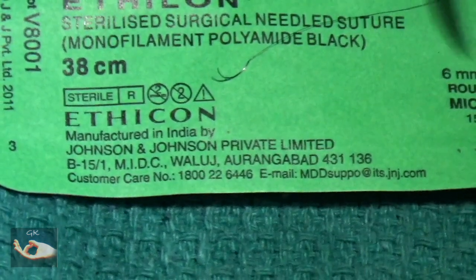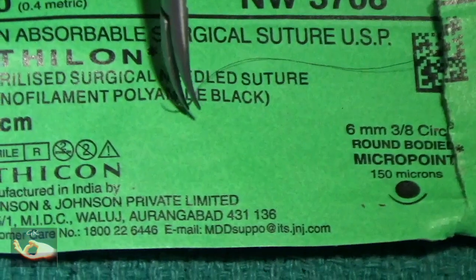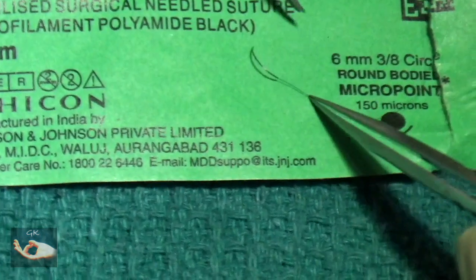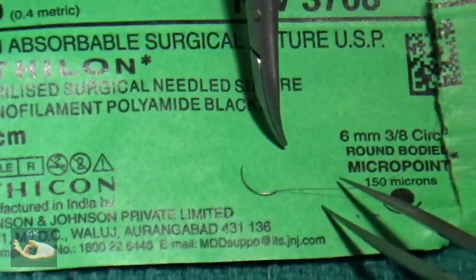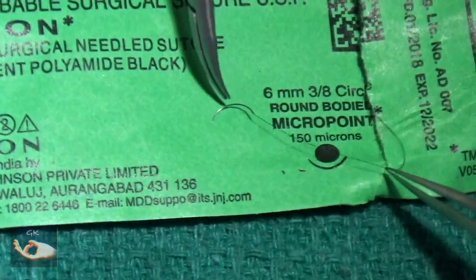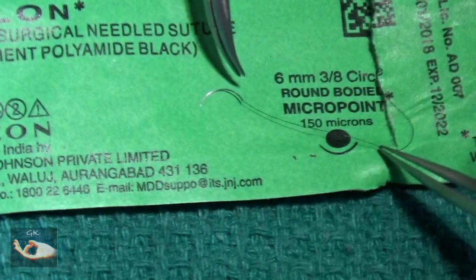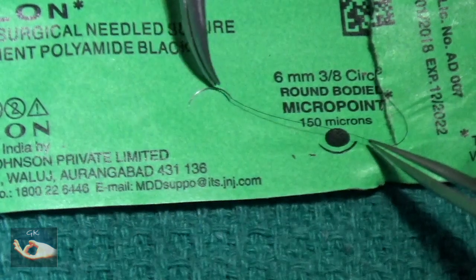The 38 centimeters refers to the length of the suture material. Describing the needle, 6 millimeters refers to the length of the needle. The 3/8 circle refers to the circle of which the curvature of this needle forms a part. The round body refers to the cross section of the needle, which is round here, as opposed to cutting or reverse cutting — the cutting where the sharp edge is on the concave side and the reverse cutting where the sharp edge is on the convex side.